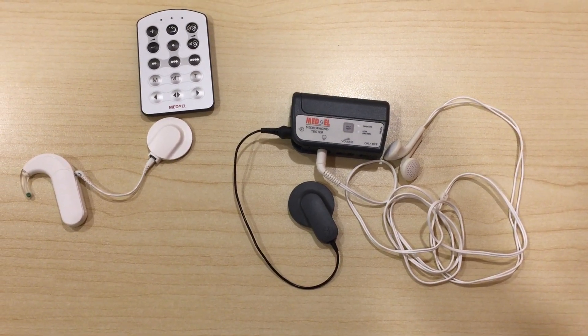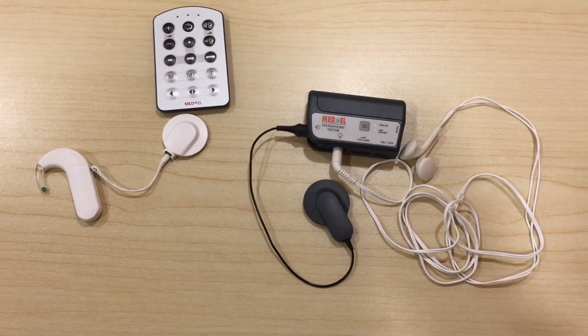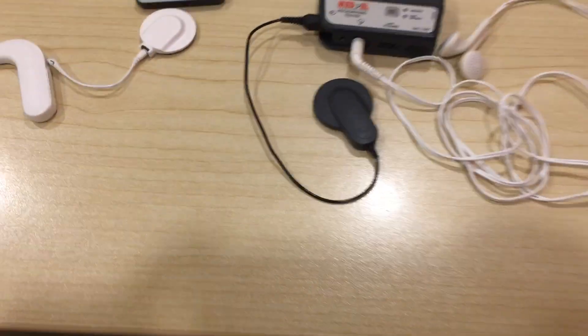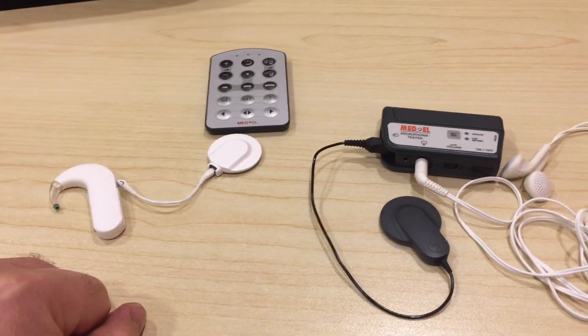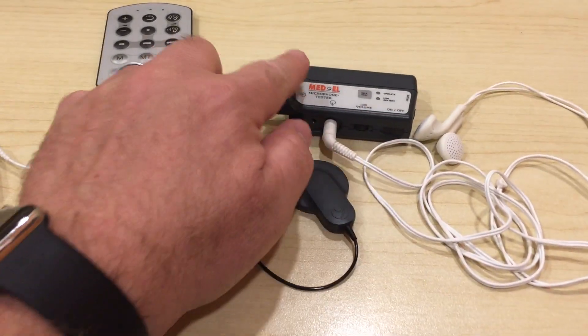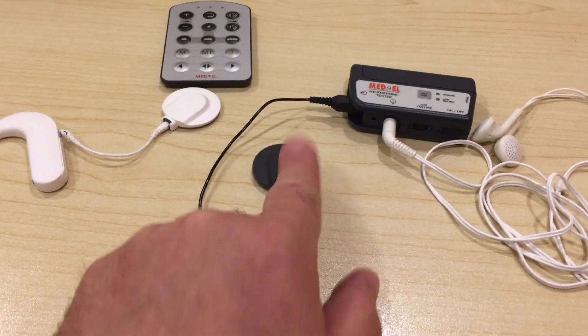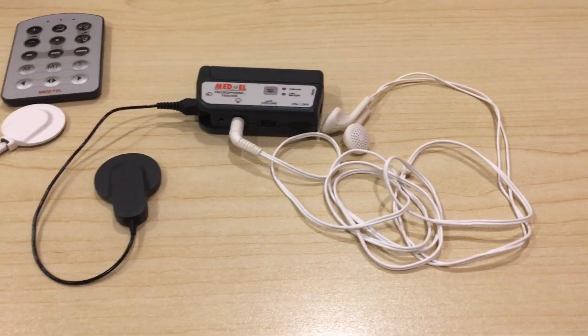This is an explanation about how to do a listening check to the microphone of Sonnet and Sonnet 2 processors. The parts that we need are the Sonnet processor or Sonnet 2 processor, a fine tuner, the microphone test device with the compatible cable, and a pair of headphones.